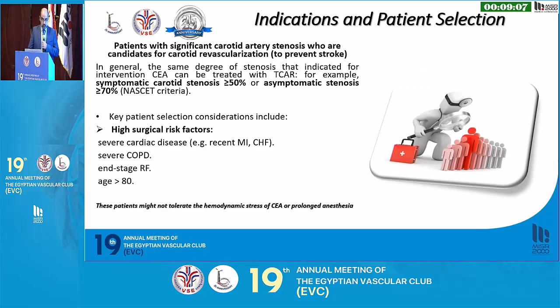About the indication and patient selection for the TCAR: patients with significant carotid stenosis who are candidates for carotid revascularization and at high risk for a stroke. In general, the same degree of stenosis that is indicated for carotid endarterectomy can be treated with TCAR, in the form of either symptomatic patients with more than 50% or asymptomatic with more than 70%, according to the NASCET criteria.